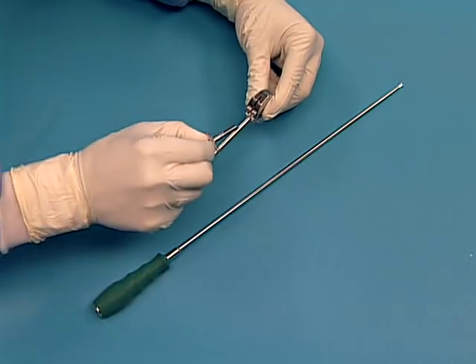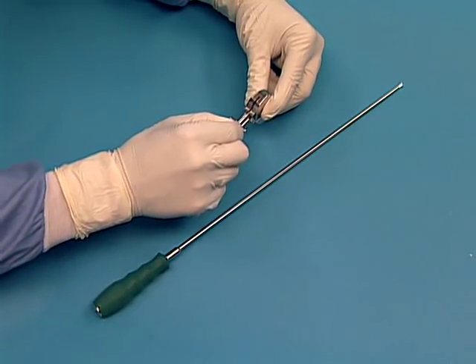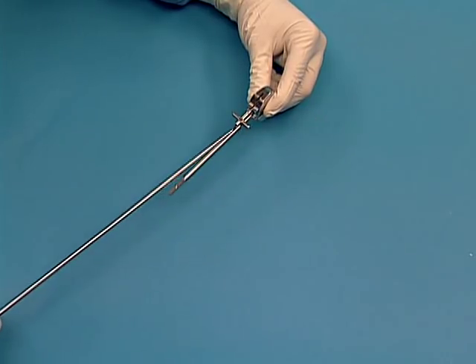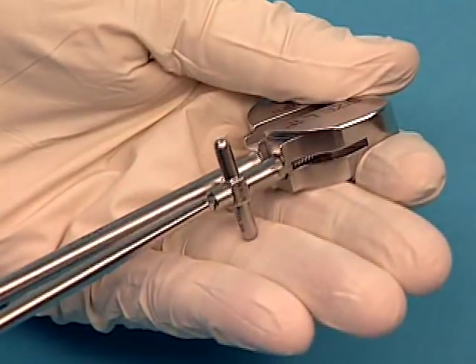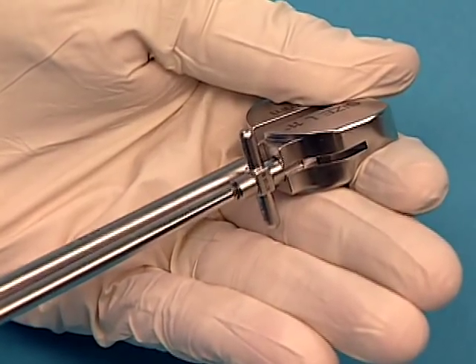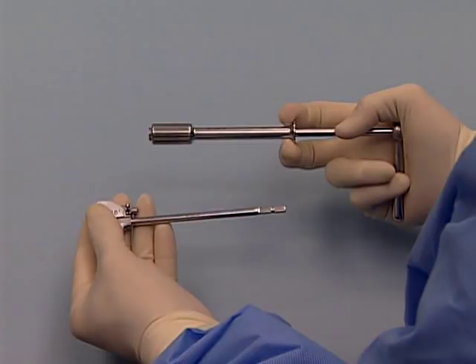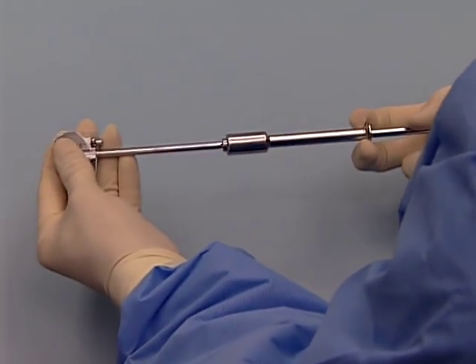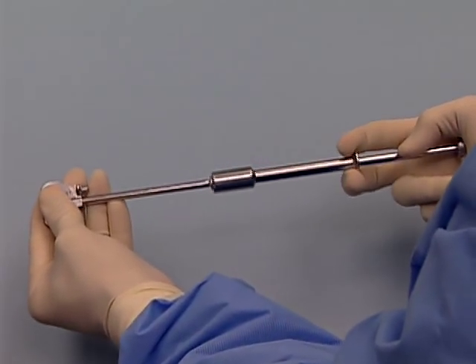Use the screwdriver to assemble the stop into the trial. Ensure the stop is fully seated in the trial. Connect the trial handle to the shaft of the trial by pulling back on the flange. The handle locks onto the shaft of the trial implant.